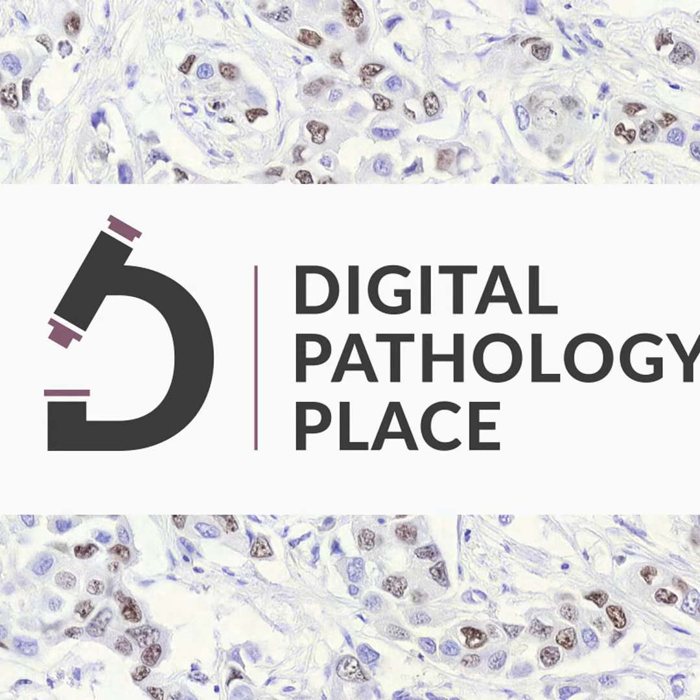So what do we have in digital pathology for this liver disease? AI has redefined fibrosis staging, donor liver steatosis assessment, which is super important, and disease diagnosis. Donor steatosis assessment is something that happens when people donate livers, and often that happens when people are in a coma, about to die, and you take a biopsy and you assess it. If it's good, then you can transplant. If it's not good, you cannot, right?